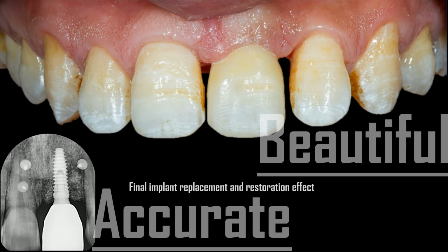Those are photos showing the final prosthesis being put into the patient's mouth. The prosthesis was fully seated and matched exactly with the implant. The labial side achieved a very good aesthetic effect. The doctors were very satisfied with this case. The AccuFab printer and Scan 3 of Shining 3D are very helpful for fulfilling the planning of the operation and their expectation of the treatment effect.